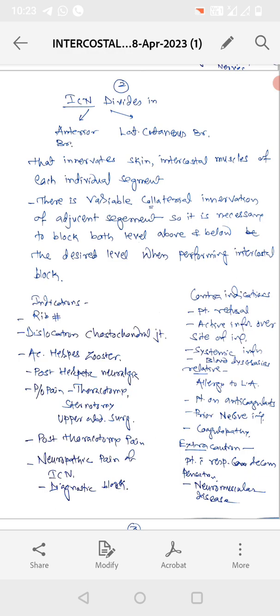There is variable collateral innervation of adjacent muscles and segment. So it is necessary to block both level above and below the desired level when performing intercostal nerve block.